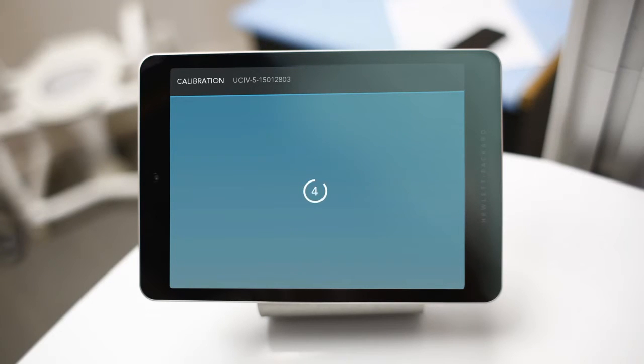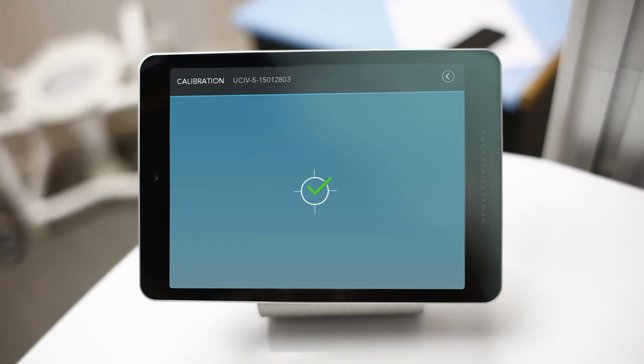Calibration should take less than five seconds and a green check mark will appear when calibrated successfully.